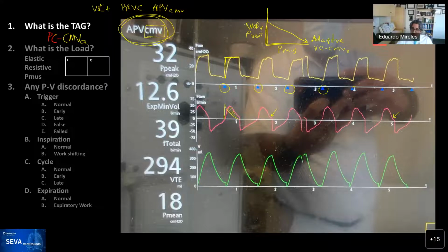We identified most of these mode variables. Alrighty, let's do another one.